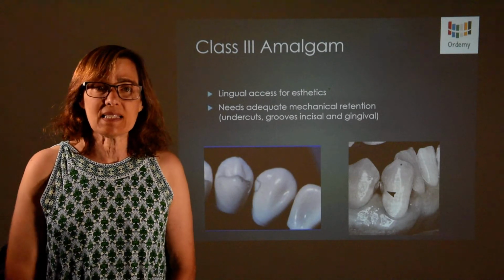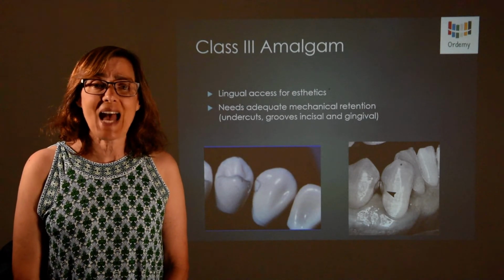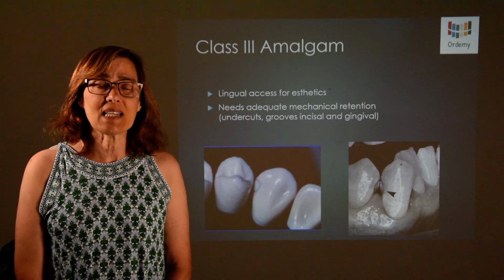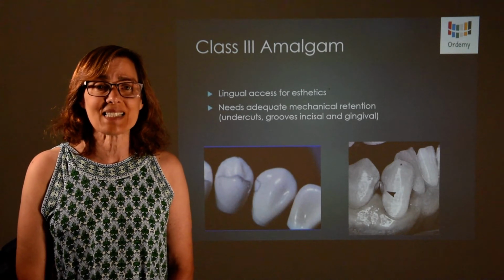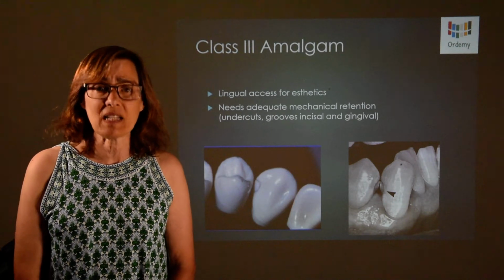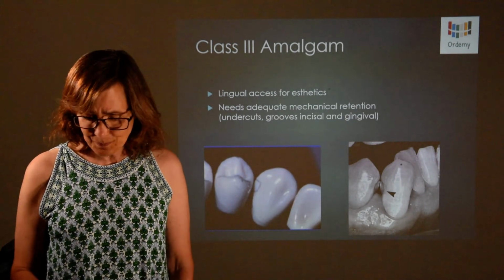And normally, the dentist wants to conserve the facial portion of the tooth, therefore he accesses the decay from the lingual portion. So not only is the cavity located in a difficult position, but the access to the cavity is solely, if possible, from the lingual area. Therefore, both of those criteria make this somewhat of a challenge.